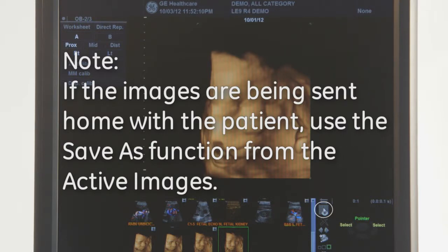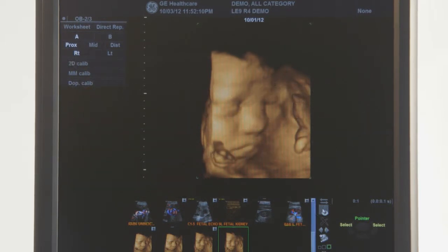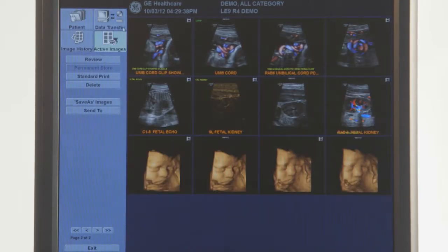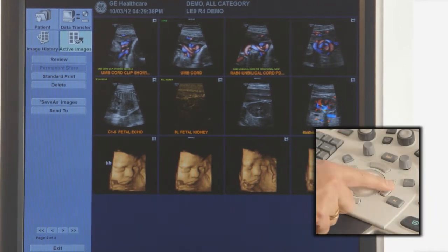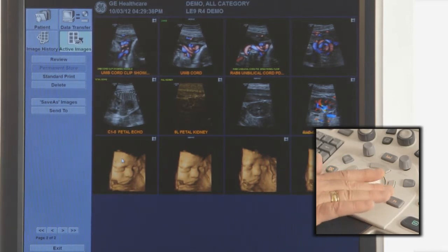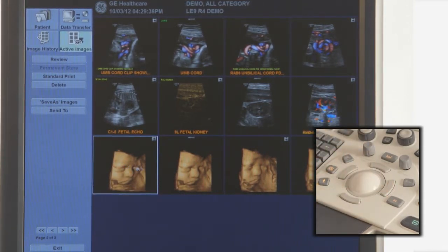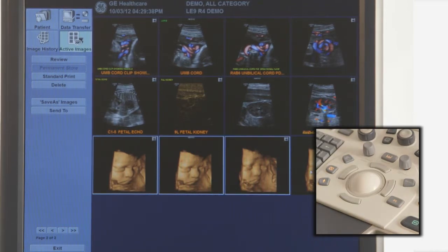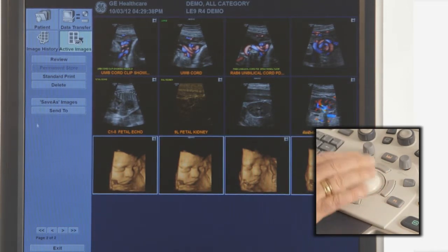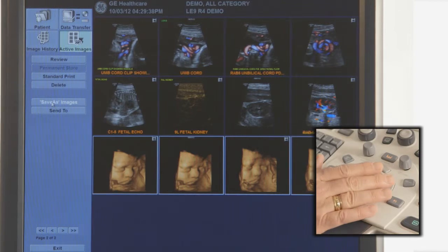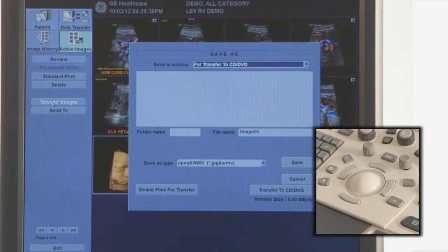To save images from the active image page, resume or review a study from the archive and choose Active Images in the upper left of the monitor. Highlight the images to be copied from the displayed images or press Select All on the touch screen.